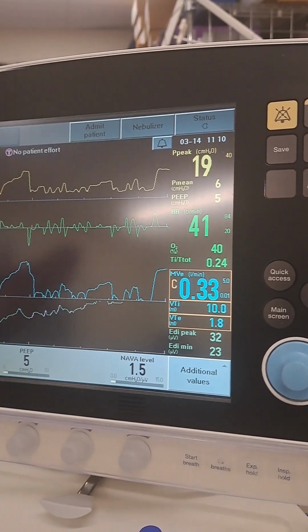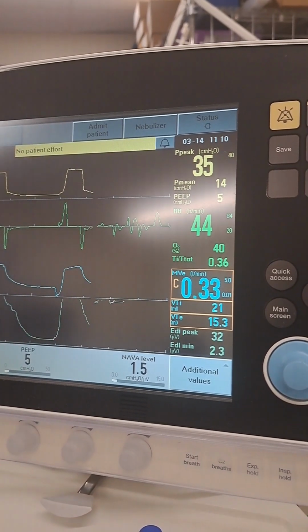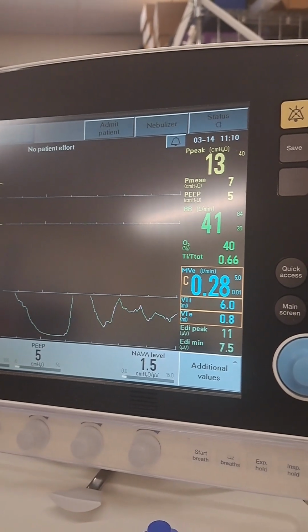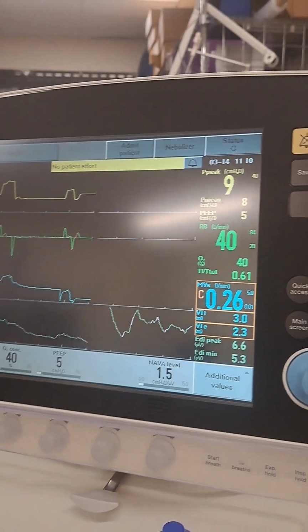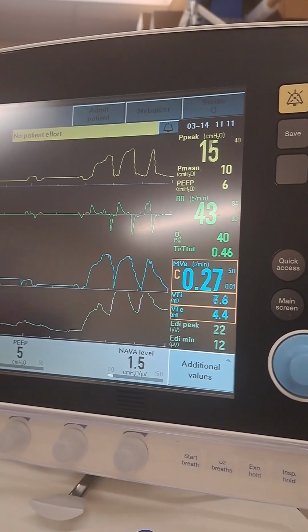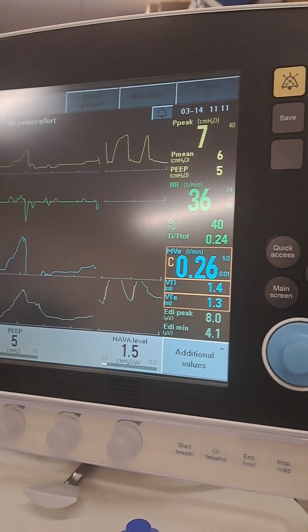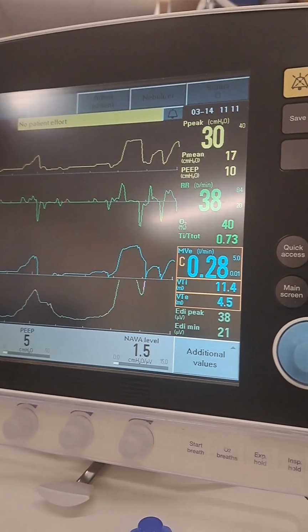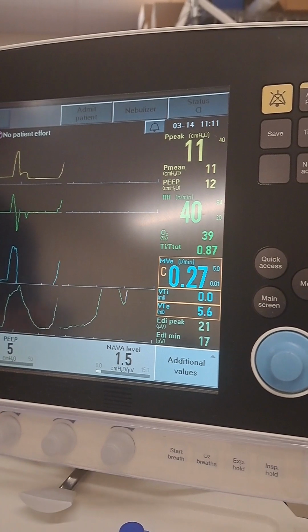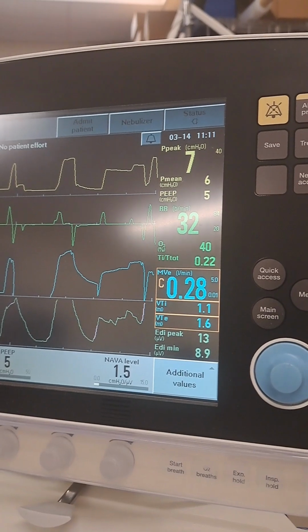You're targeting mid-range, because micropreemies are really bad for this when you put them on, like this is invasive NAVA, right? You put them on NAVA, you do your preview and say it's 2, and it looks great, and then a day later you're looking at them and they're just chilling and their EDI peaks are 5, 6, very low. Then you would want to challenge them and turn that NAVA level down so that your EDI peak is more of a 10, something like that.